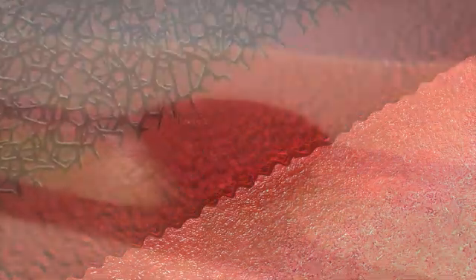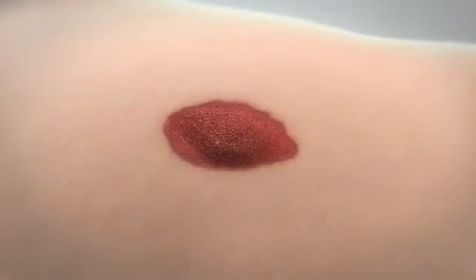Over subsequent dressing changes, the granulation tissue fills the wound bed fast, preparing it for final closure.